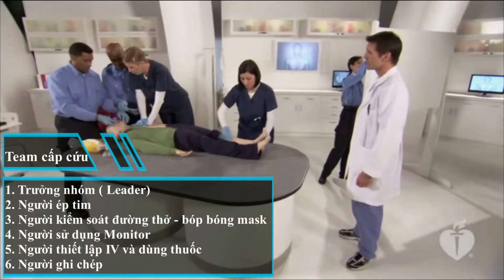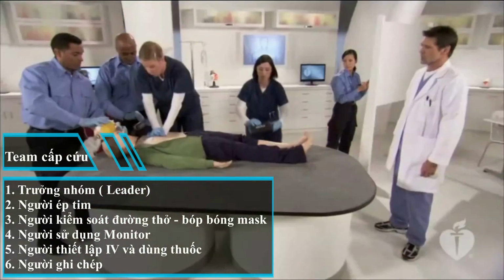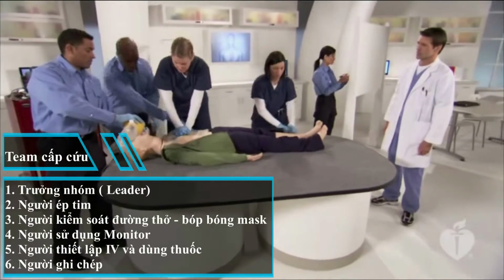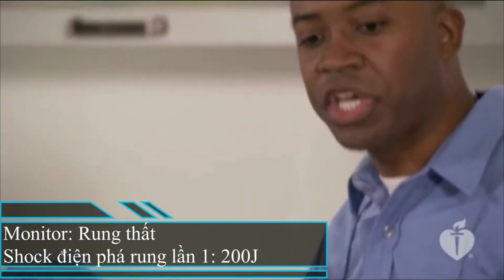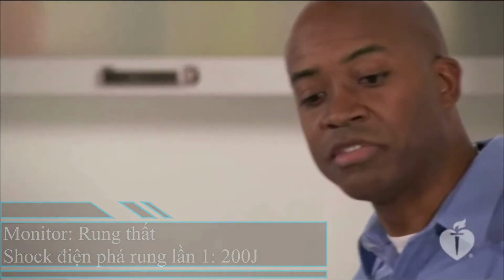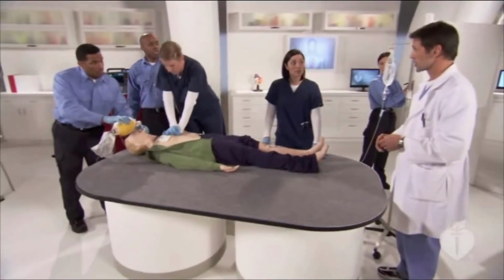Moving to IO access. Charging at 200 joules. Shock ready, clear the patient. Shocking on 3. 1, 2, 3. Shocking. Shock delivered. I have IO access now. Great. We'll continue CPR for 2 minutes and evaluate the need for additional defibrillation.